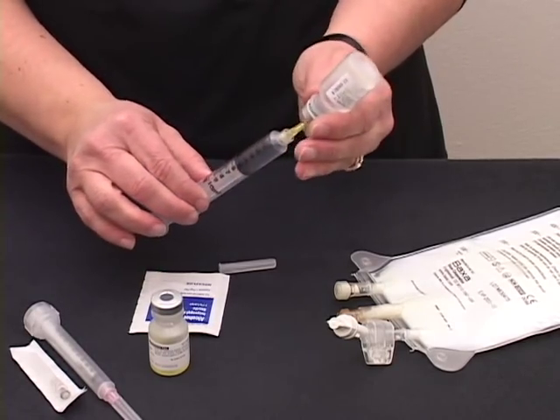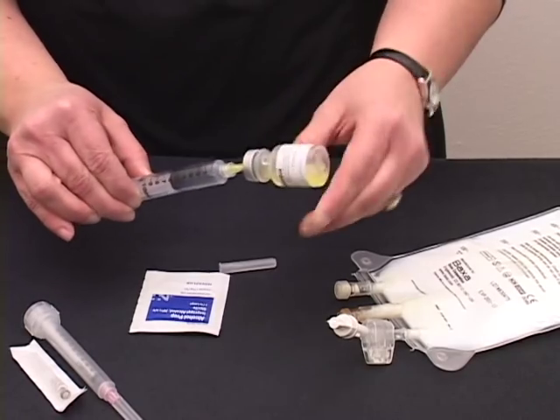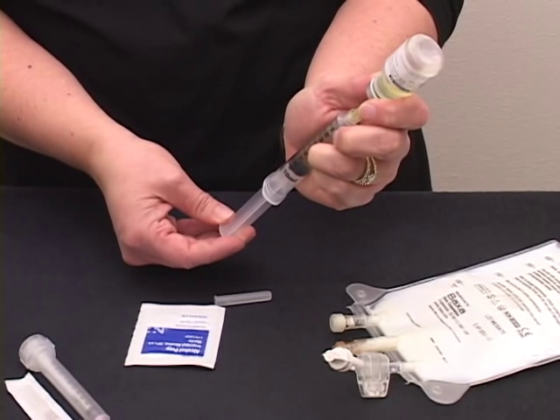Once you have the ordered amount, remove the needle, stick it into the other vial and continue to pull back the ordered amount of the second vial.